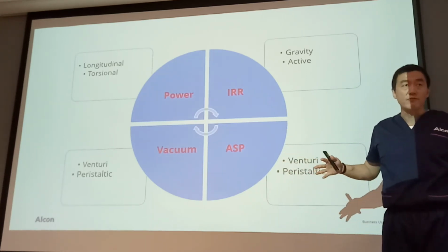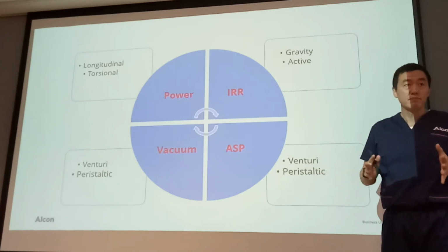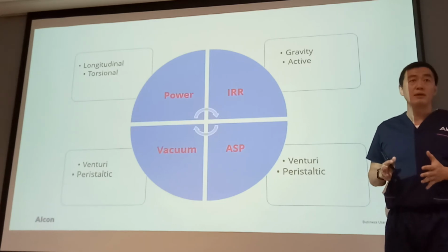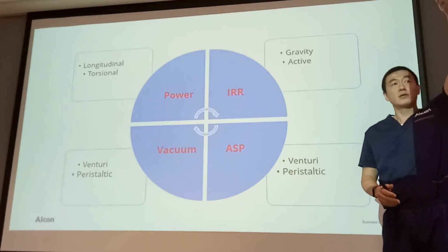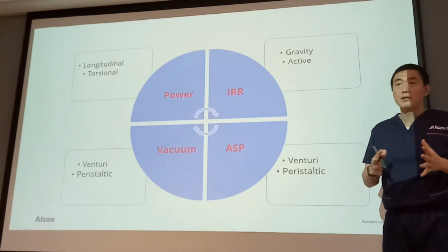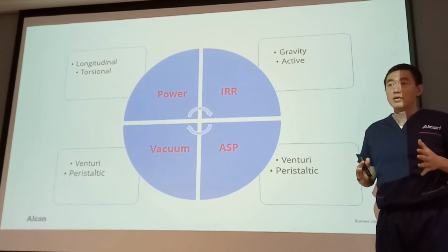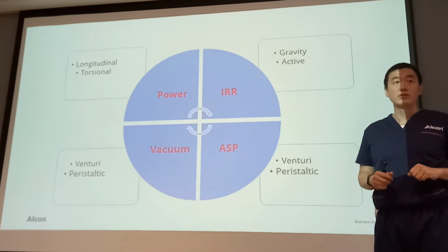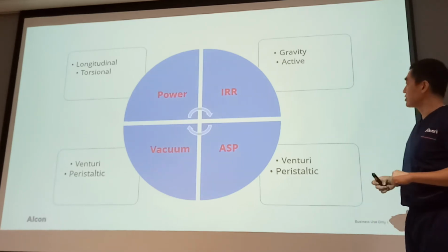Nowadays we give different acceleration by machine pressure. We can give more. Before, we could only increase the bottle height to give more pressure. Now we can dynamically give pressure to have a stable anterior chamber, which is more advanced technology.